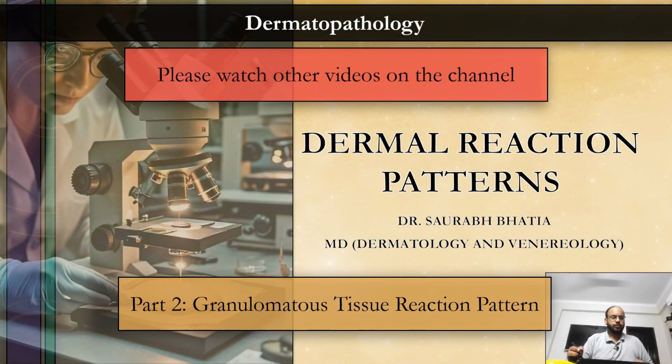Good evening, everyone. So we will continue our lecture series on dermatopathology, and this week we will be discussing the granulomatous tissue reaction pattern. Now, in the previous weeks, we have discussed the lichenoid tissue reaction pattern, and prior to that, we discussed how a normal epidermis and a normal dermis look under a microscope. I hope that you are finding these lectures useful and you are utilizing things that you learn while you are analyzing the biopsy reports or the slides if you are able to see them under a microscope.